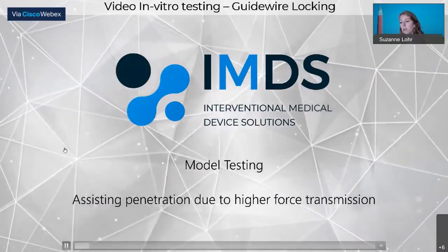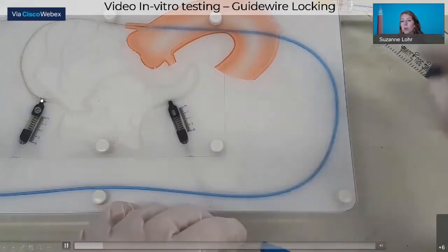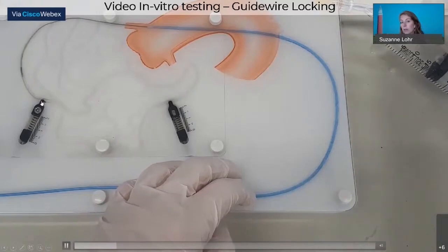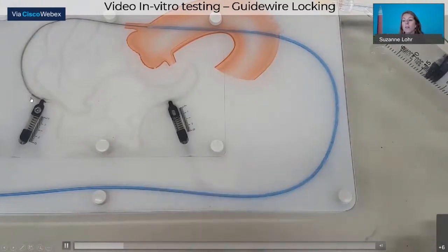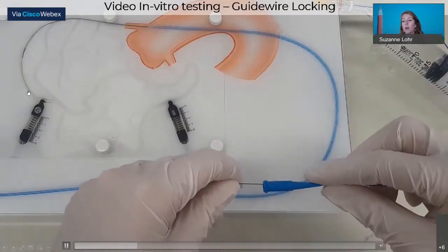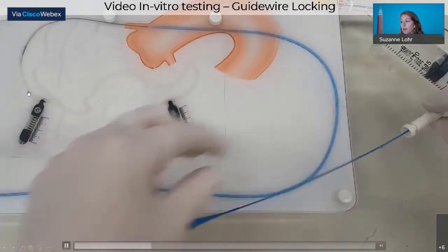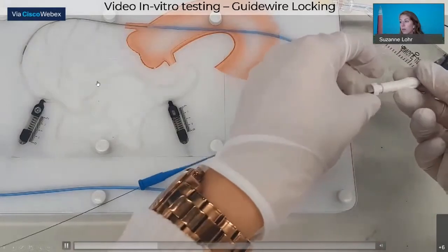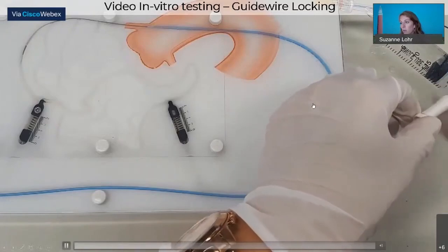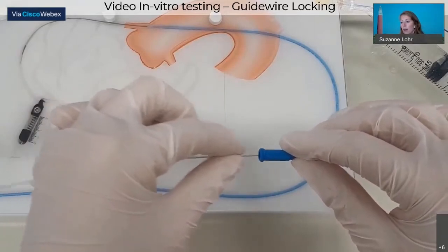So first is assisting penetration due to higher force transmission. This is a model with an occlusion, and the guide wire is not able to cross the simulated occlusion that is shown on the left side. So we advance the microcatheter, but still the guide wire cannot cross and it starts backing up. Then we have this locking device, which can be unlocked and can be locked again. It can only be locked with the guide wire inside and at approximately 4 centimeters away from the hemostasis valve. And here it shows that it fixes the guide wire.